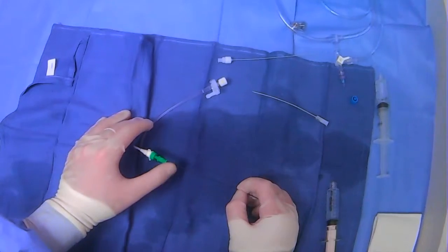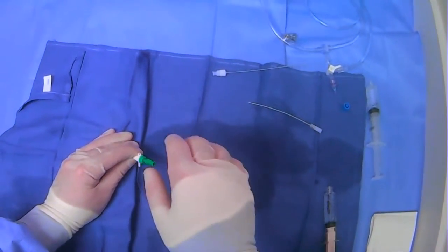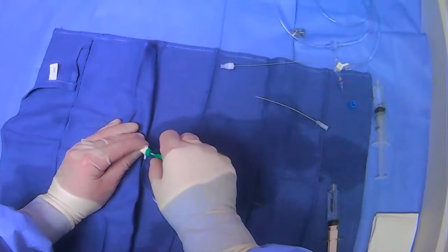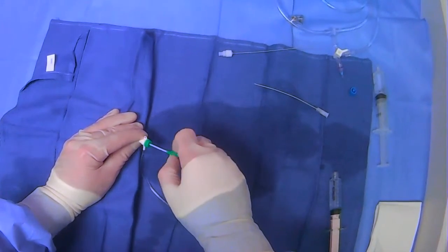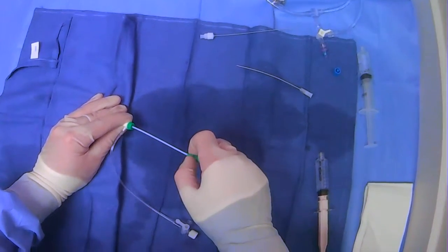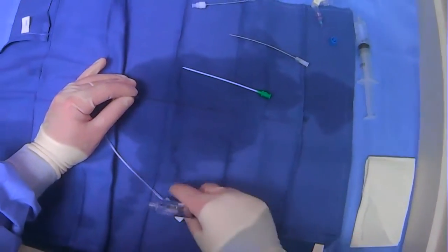Remember that we have flushed this and closed this, so no blood will come back. What we can do now is take out the little introducer. You want to be careful not to move your wire while doing this — you kind of pinch-pull with one hand, hold, and then you hold this here, take this out, and then we have things in place.